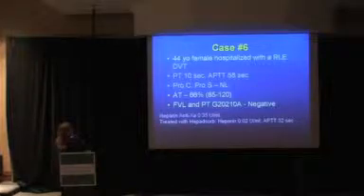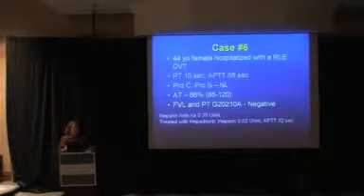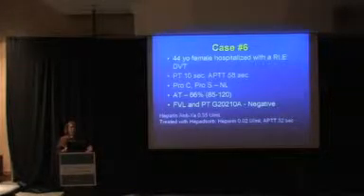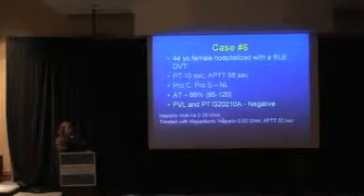So we would screen the samples for heparin, and there are a lot of different ways to screen hypercoag samples for heparin. You can do a thrombin time to pick up heparin. The nice thing about thrombin times is that they also pick up direct thrombin inhibitors, and we're seeing more and more use of direct thrombin inhibitors. In this case, we did a heparin anti-10A assay that came out positive.